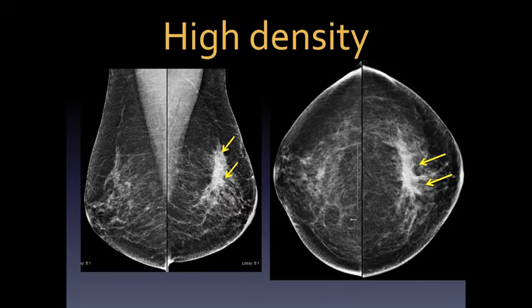We always look at prior mammograms when interpreting for abnormalities. This appears to be a suspicious mass in the upper outer quadrant of the right breast, and looking at the prior it might seem new. But going back another two years earlier, you can see this mass was already present — it is a benign mass, nothing to worry about, no need for further investigation. Prior imaging reduces abnormal recalls by 5%, and we try to obtain priors within two weeks to reduce unnecessary recall.